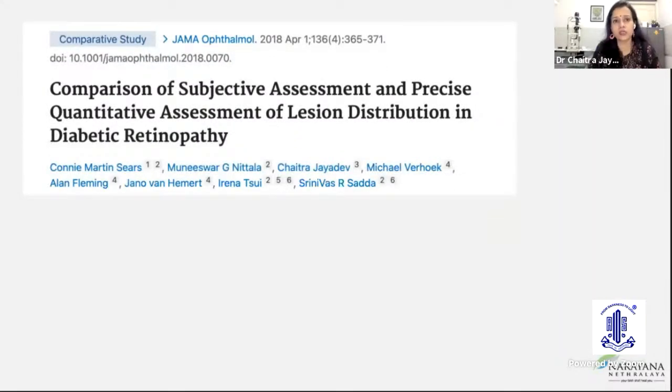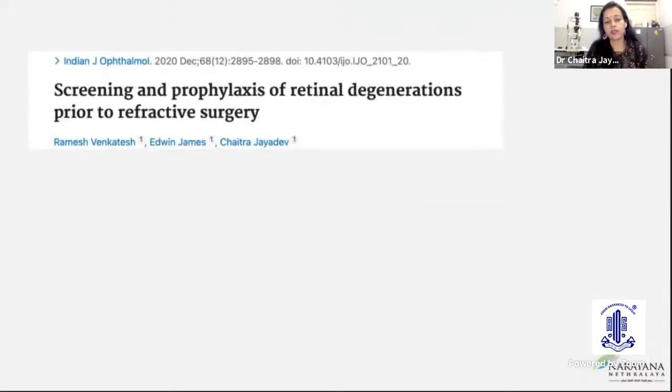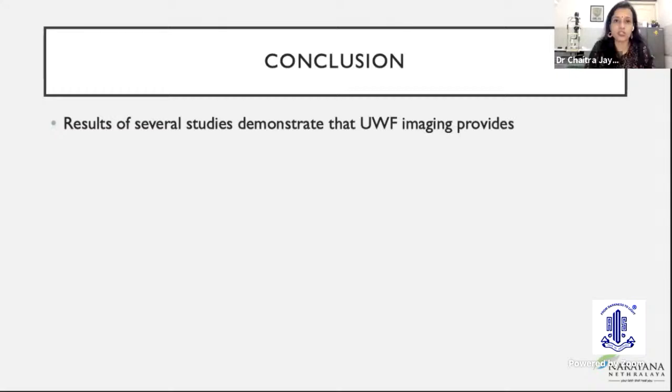We have done a lot of studies. This was in 2018, again, with Dr. Sada's group, where we could see automated reading. We are trying to do automated reading of these ultra-wide images so that it helps us in screening. These are some of our recent papers that we published in a respective journal, where we could pick up peripheral retinal degeneration much better than clinical examination. So we did the sensitivity and specificity for these lesions.